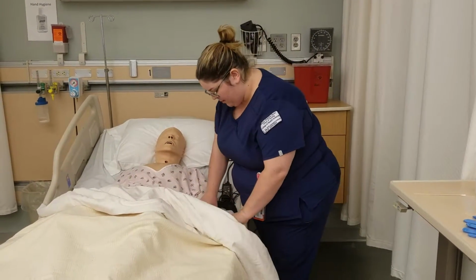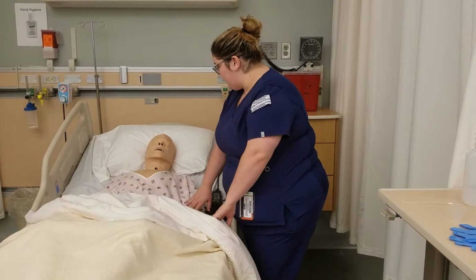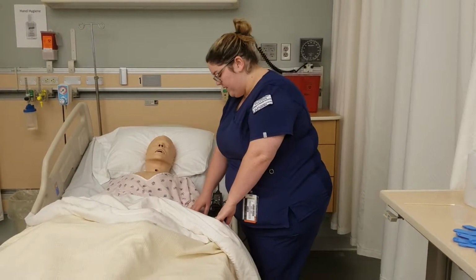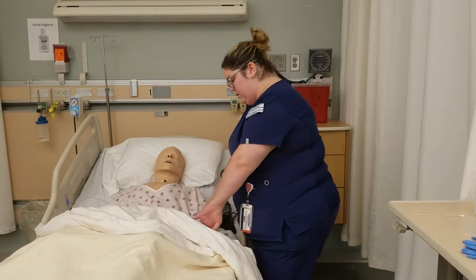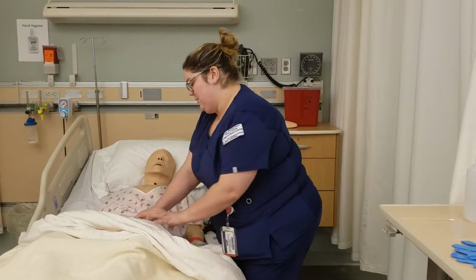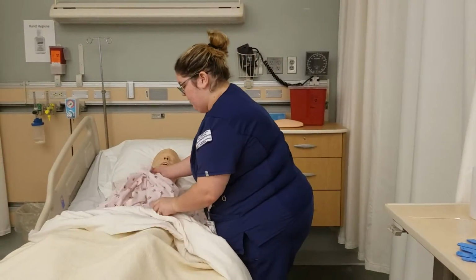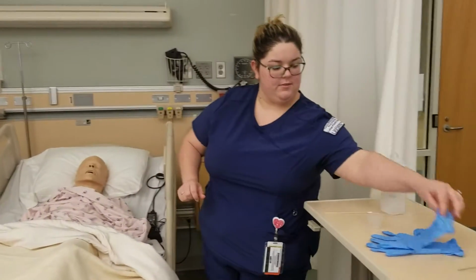I'm going to identify my patient. Hey, Mr. Smith, how are you doing today? Can you tell me your name and date of birth, please? Do you have any medication allergies? I see that you are allergic to Demerol. I'm going to remove the site. I'm going to don gloves.